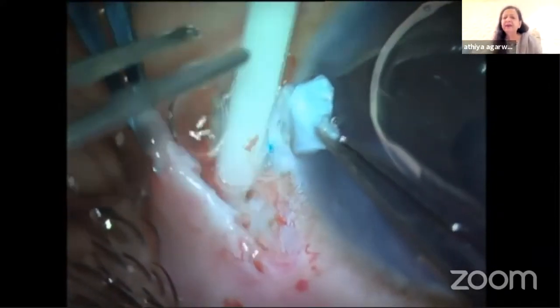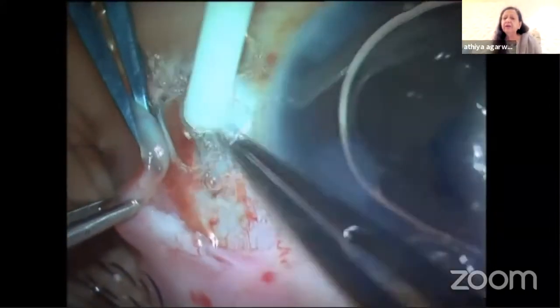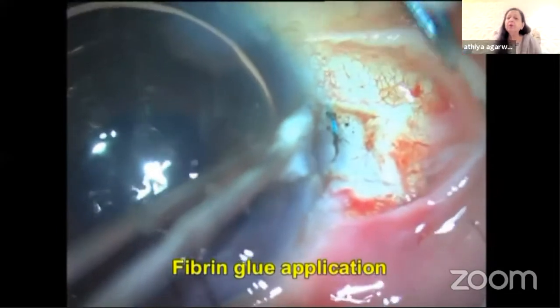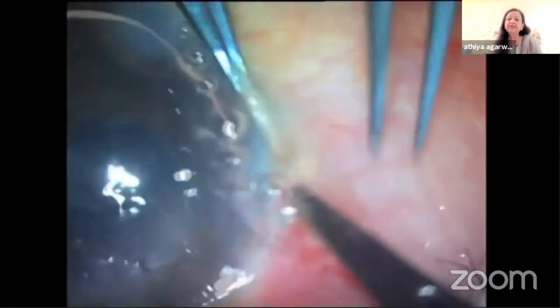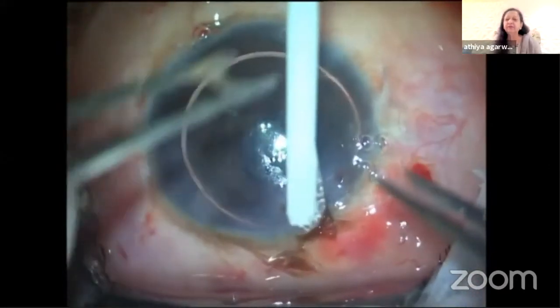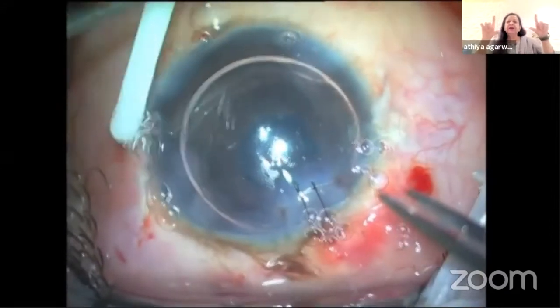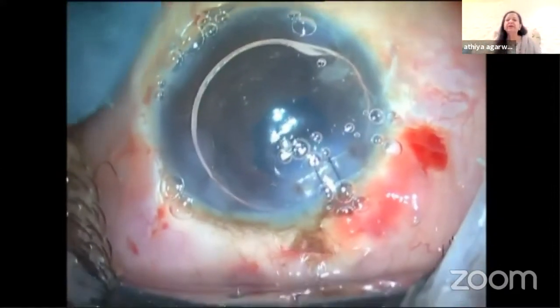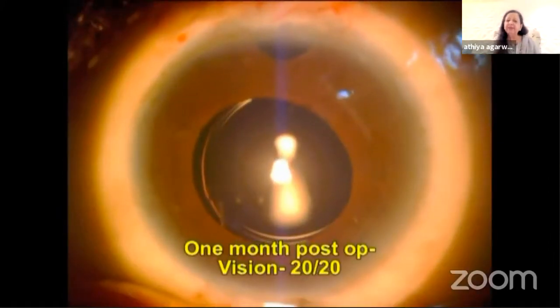tucked the haptics behind using the fibrinogen thrombin combination, glued the scleral flaps, glued the conjunctiva. This is called fibrin glue, which is nothing but tissue glue, manufactured by a company called Baxter in Germany. You can use this glue for at least 5 to 6 cases if you open one. It comes in 2 vials in a combination of fibrinogen thrombin. I've closed all the holes which I created to put my iris hooks to visualize it better.